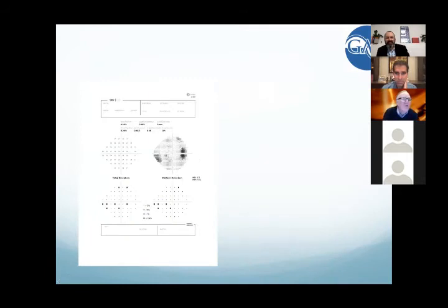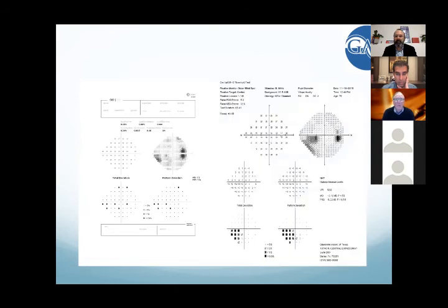So we have here, you can see the virtual platform. The false positive rate here is really outstanding, 0. This is a well-trained perimetry subject. And no fixation losses. Now, this, if you advance it, I think it will show up there's the Humphrey. So this patient has a corresponding inferior nasal step loss that corresponds to the nerve fiber layer superiorly. That makes sense. This is a reproducible defect. And it shows up quite nicely on the virtual platform.